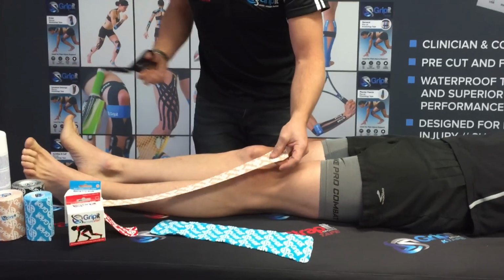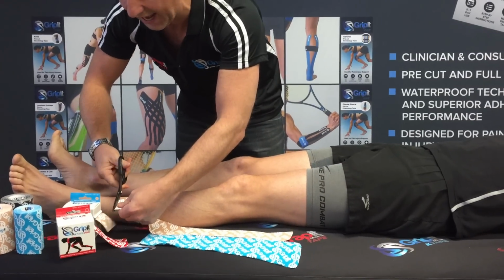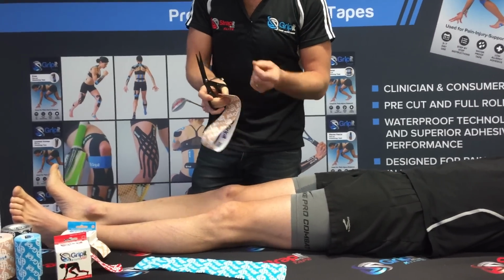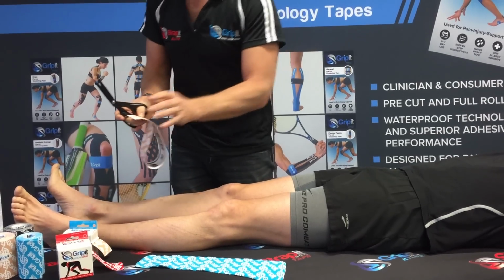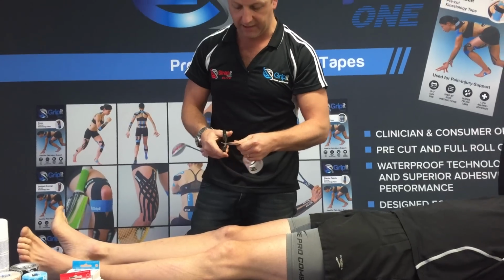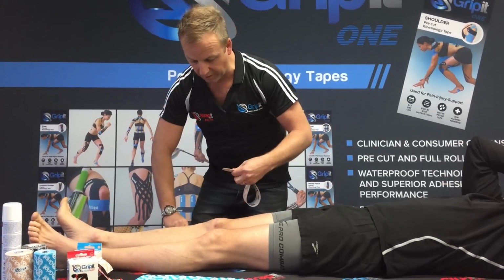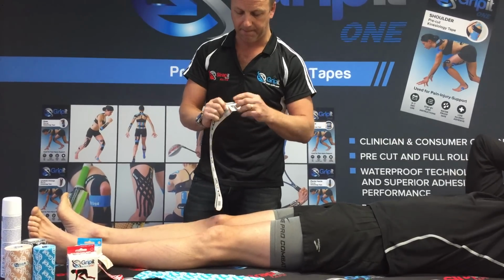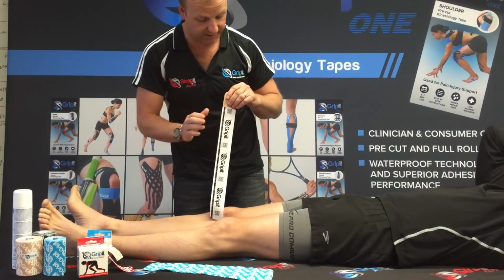Now, I'm going to start with the 5 centimeter here as an underlayer. There are a few different ways you can do it, and you can also look to provide a technique where you might choose to do 2 layers, so a double layer technique, and a combination of the 5, the 7.5, or the 10 centimeter. So let's start with the 5 centimeter as the underlayer. Importance around the edges so we don't see any sort of giving of those ends, which can happen if they're sharp edges. Also, you may choose to use some form of pre-spray when you're doing this technique.